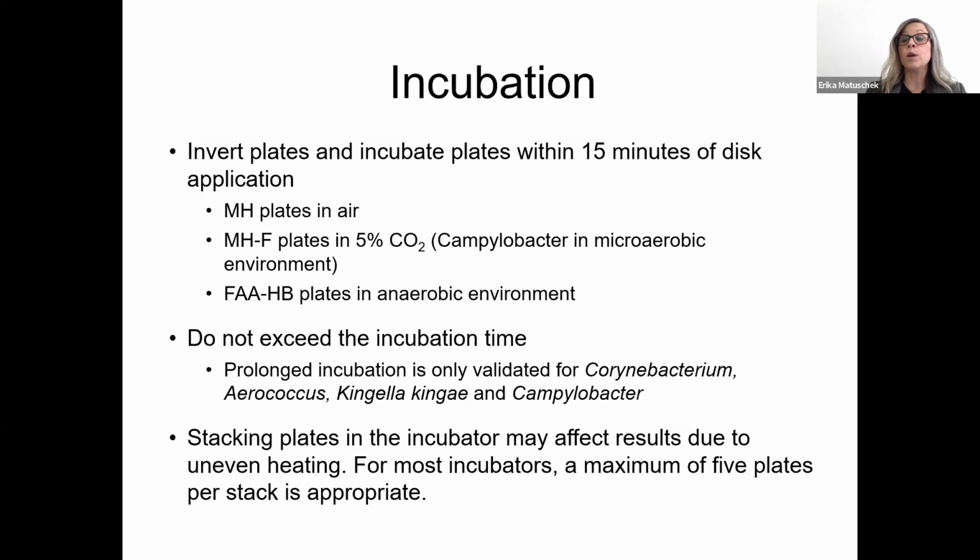So for these organisms, when you look at your plate after 16 to 20 hours, or 24 hours for Campylobacter, and you don't have sufficient growth, then you can prolong incubation. For other organisms, we have not validated this, but we know from our studies and experience that the zone sizes might change a lot with prolonged incubation. So that is not recommended unless specifically stated.